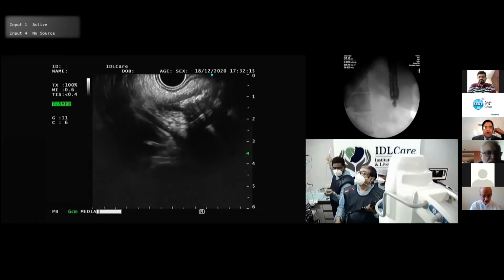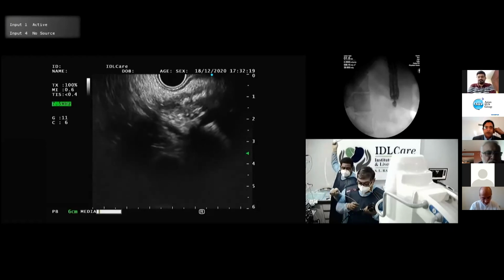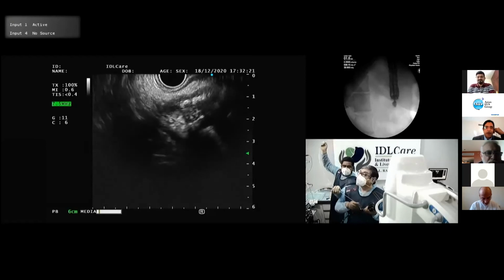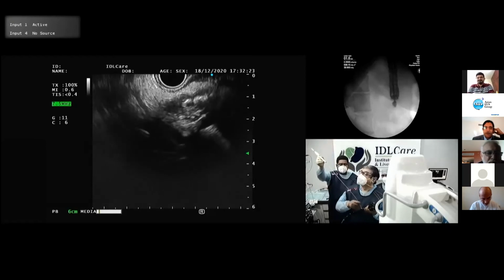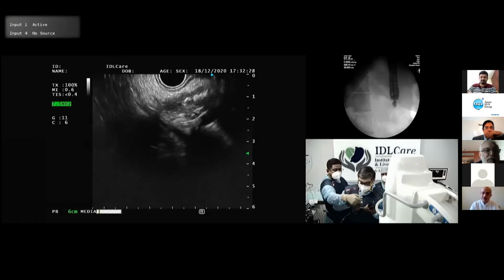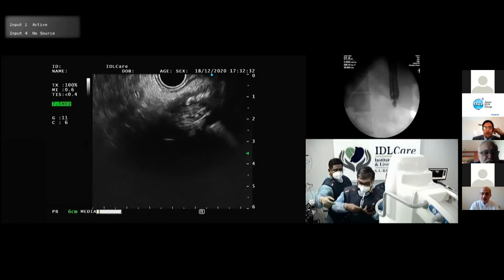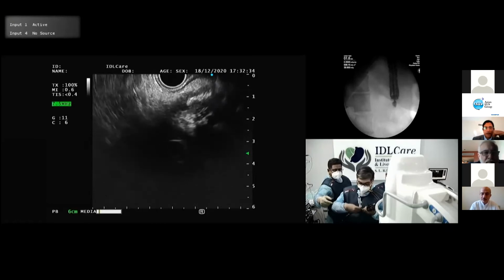Here it is a double trouble actually. Through the stomach is difficult and 19 gauge is such a big needle and such a hard pancreas. So I think you're right, you're right. A cocktail. So I am changing my needle, hoping that it will work. Easy shot 3.